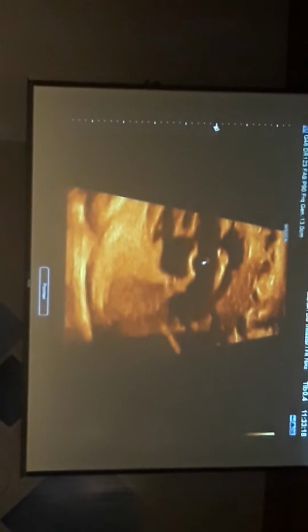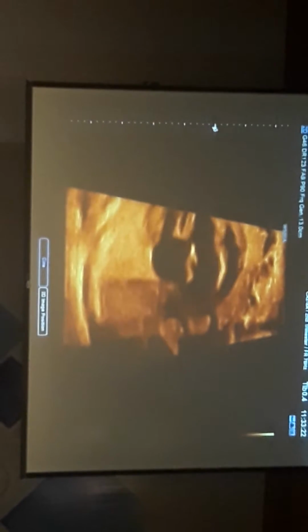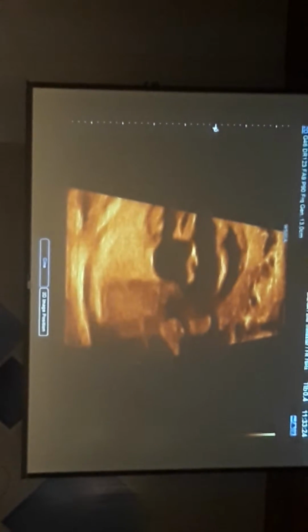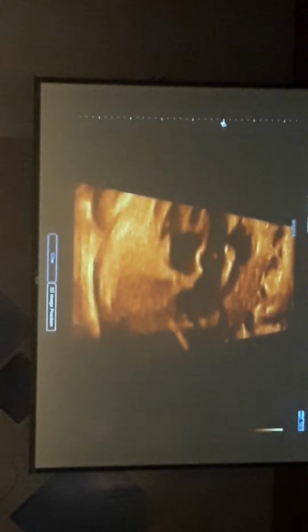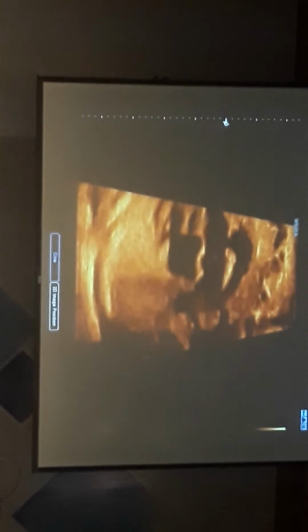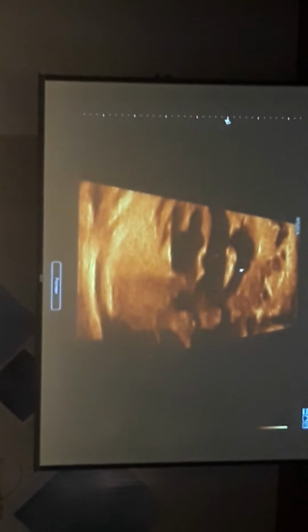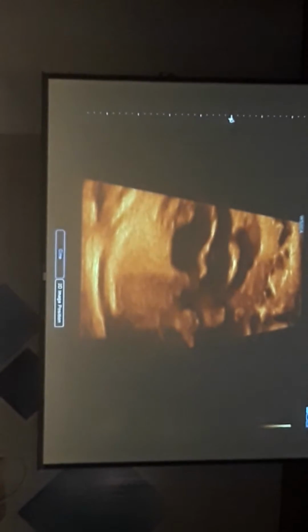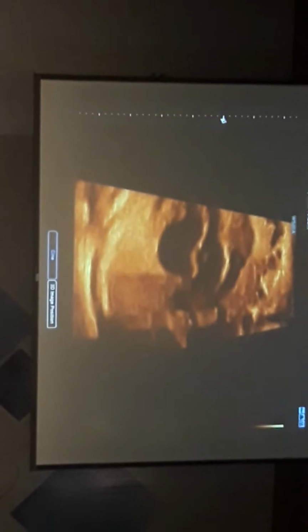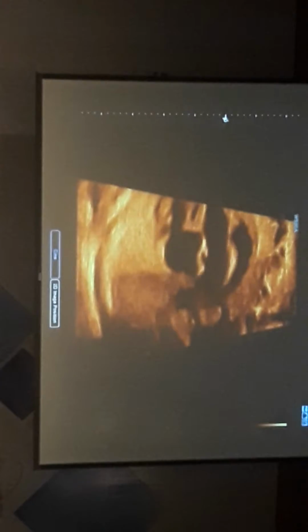It's important to look at the valves. Look at the pulmonary valve. It disappears, comes back to midline. It looks normal, just big. And here's the aortic valve, which actually opens up nicely, but it seems small.